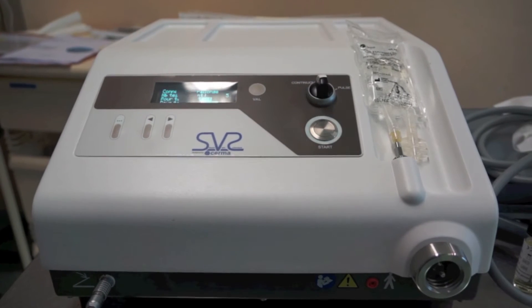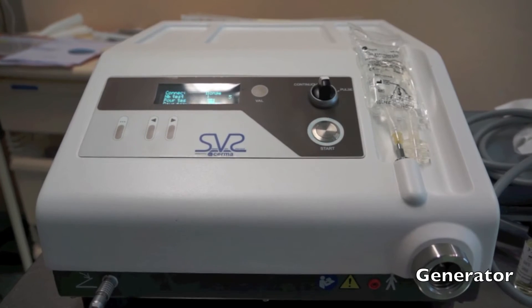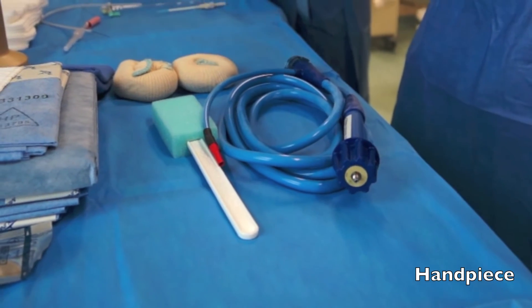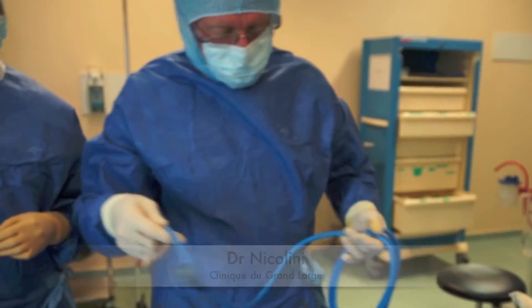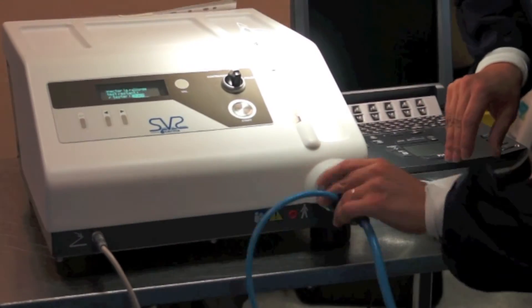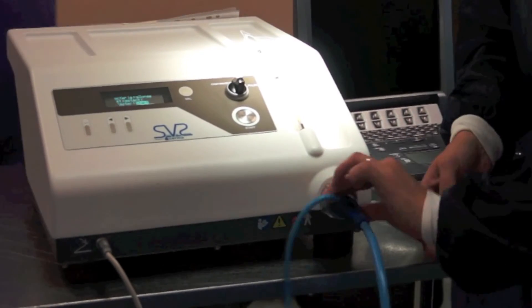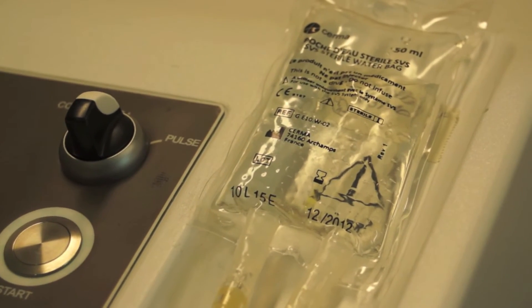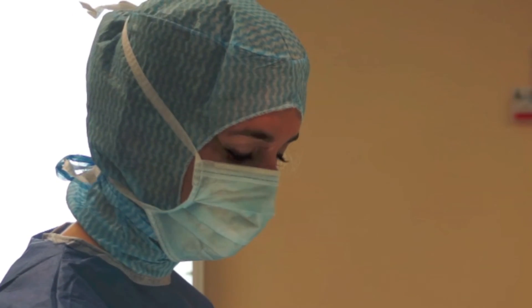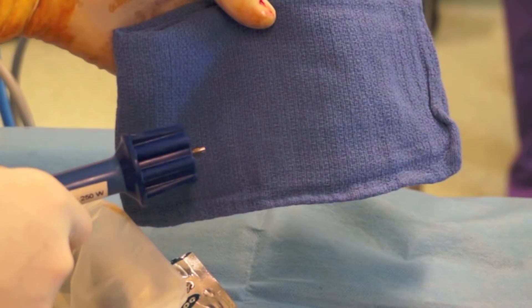Recently I went to Lyon to see Philip Nicolini perform the procedure. The endovenous thermal occlusion of varicose veins with the steam vein sclerosis system consists of a generator, a heating handpiece, and specially designed catheters. The generator provides the energy for the procedure and transfers sterile water from the water sachet into the handpiece, where it is immediately heated and transformed into superheated steam at 120 degrees Celsius.